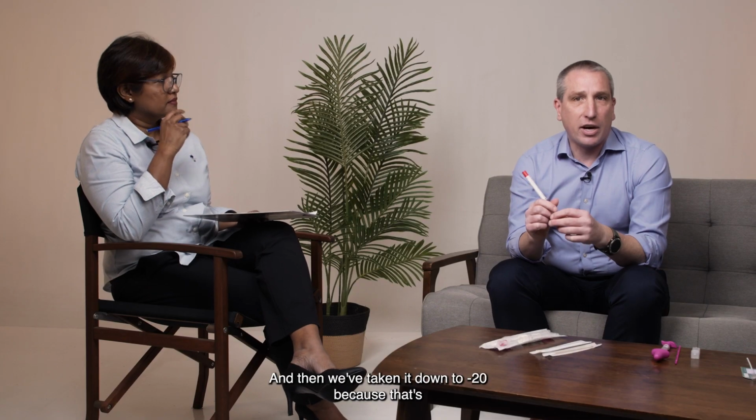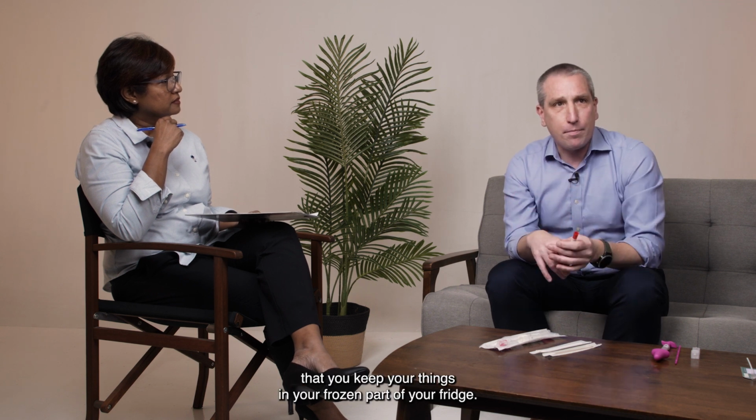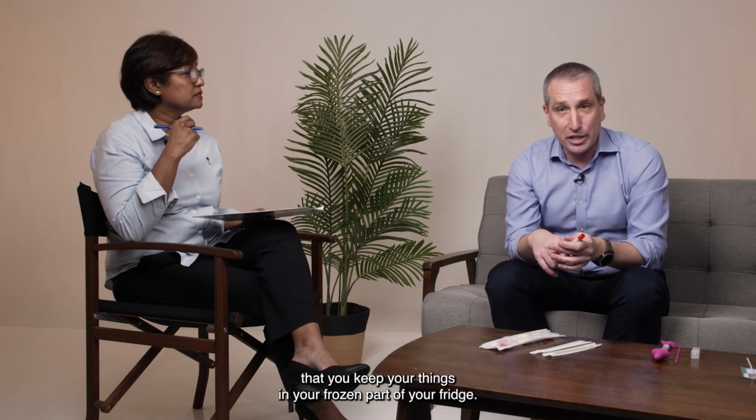And then we've taken it down to minus 20 because that's the coldest recorded temperature. And that's the temperature that you keep your things in your frozen part of your fridge. And that is absolutely fine as well. So DNA is really robust.